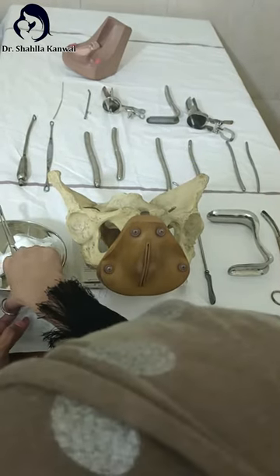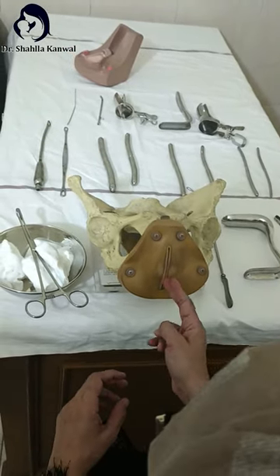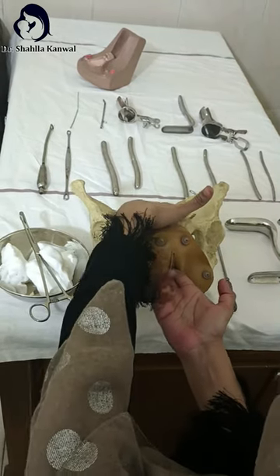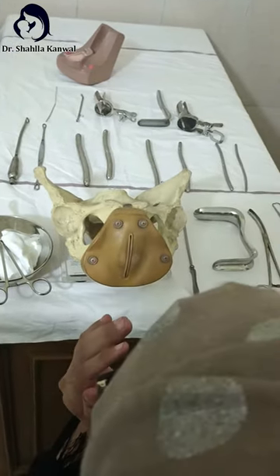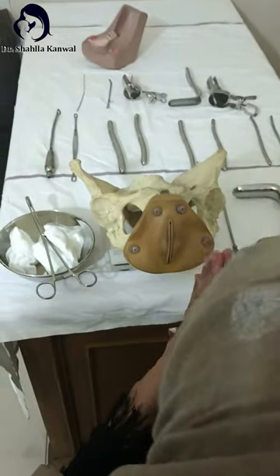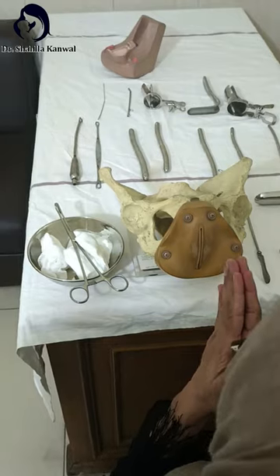After cleaning, you have to perform the bimanual examination. Put your two fingers in the posterior fornix of the vagina and perform the bimanual examination. You have to assess the size of the uterus as well as the version of the uterus. By assessing the size and version, you can avoid perforation of the uterus, and you should also comment on the adnexa.